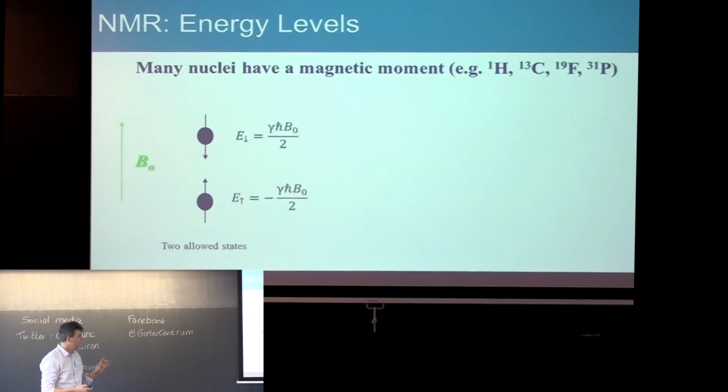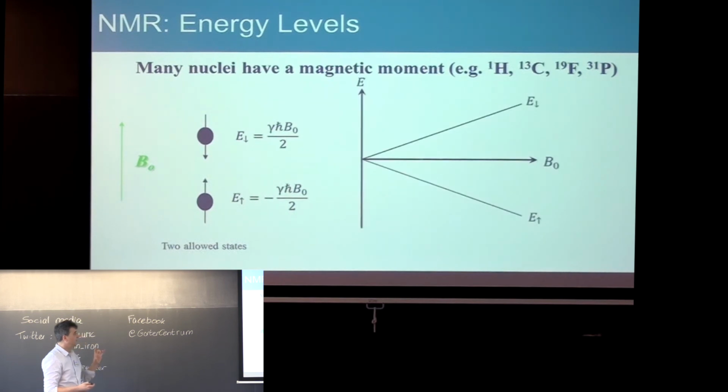And there's a very small energy difference between those two states. So it's slightly more energetically favourable for the magnets to point along the field, as you would expect from the compass needle. But the difference in energy gets bigger the bigger the magnetic field which the nuclei experience. So the bigger the magnetic field to which the sample is exposed, the bigger the difference in energy.